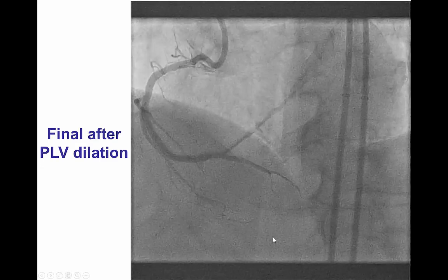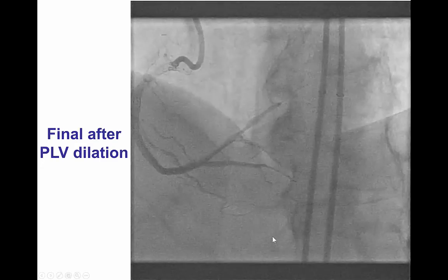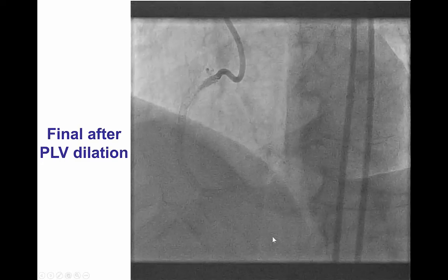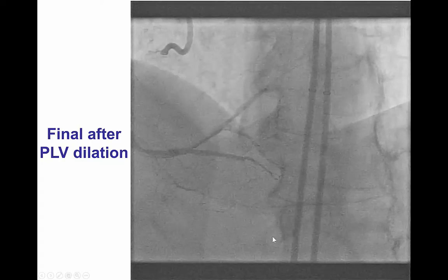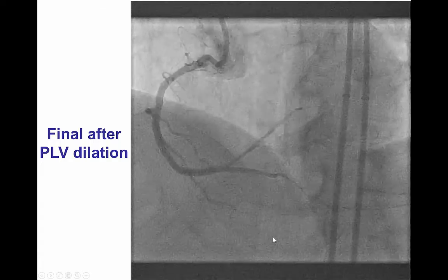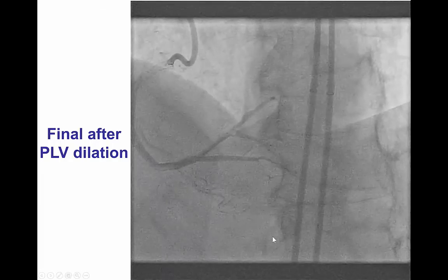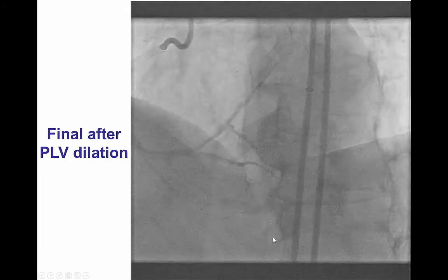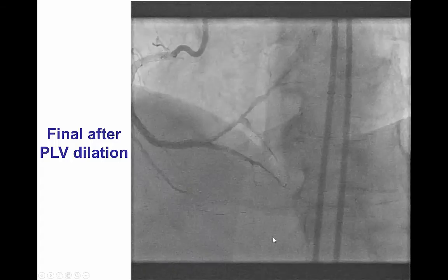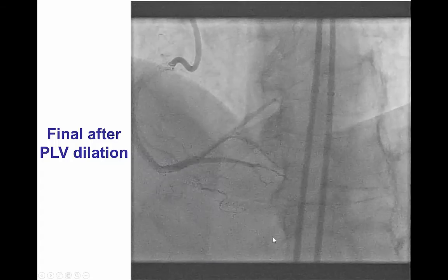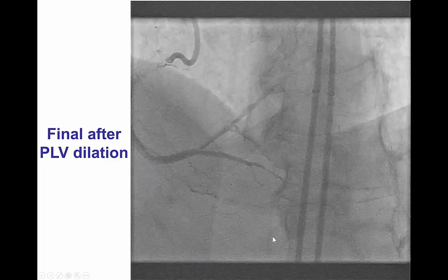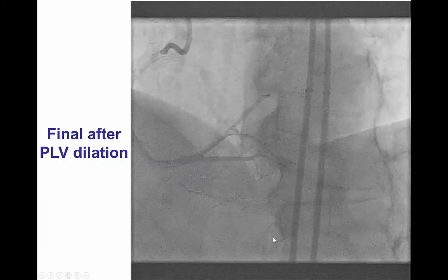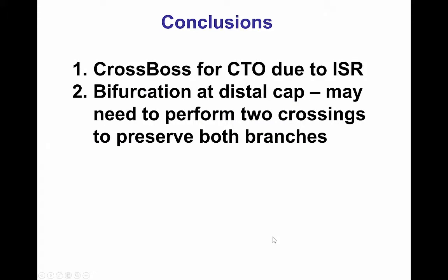However, we had significant difficulty. We performed a balloon dilation into the posterolateral vessel; however, since we never quite achieved distal true lumen entry, we decided to leave it as an investment procedure, not place any stents into the posterolateral vessel, but let the dissection heal, and potentially bring the patient back for a second procedure.